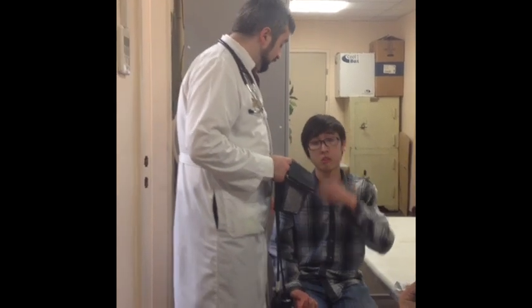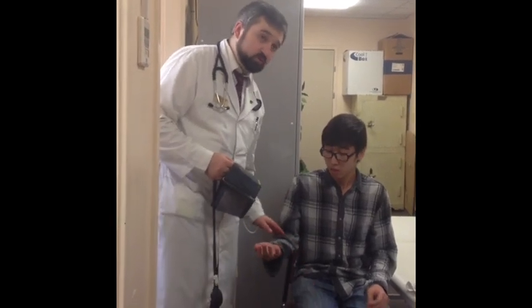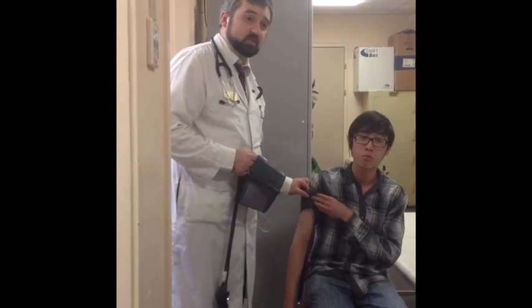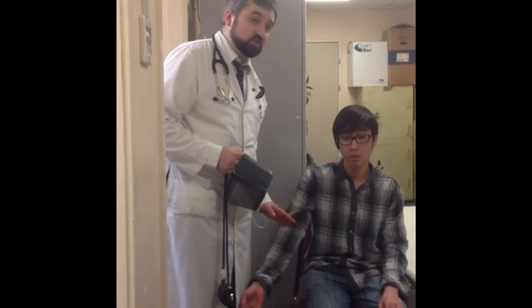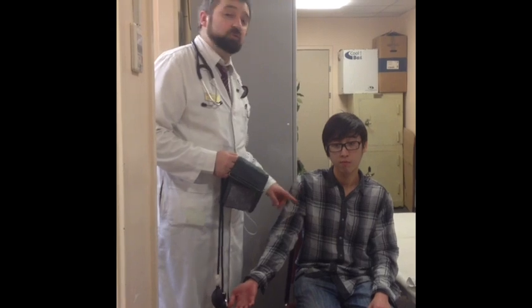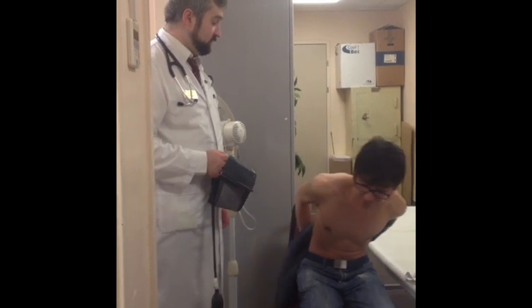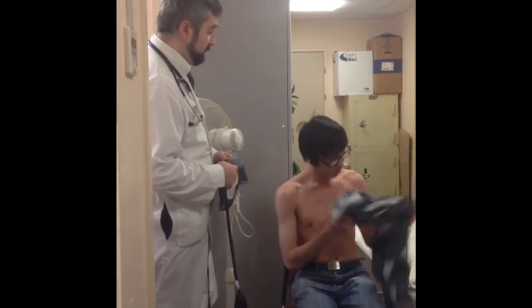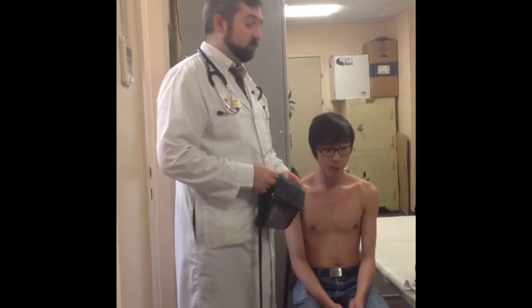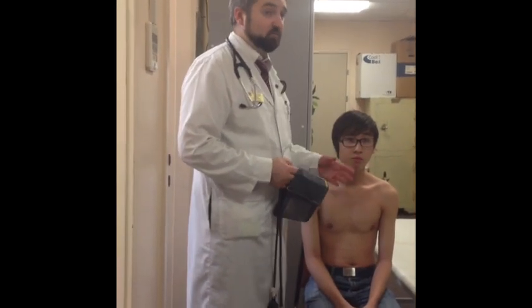You can apply the cuff on thin cotton fabric, but this fabric must be short — otherwise it is not possible to make a proper measurement. If the patient has no short jacket or short sleeve, we need to remove the clothing. If the patient is an unknown patient, we measure on both arms.